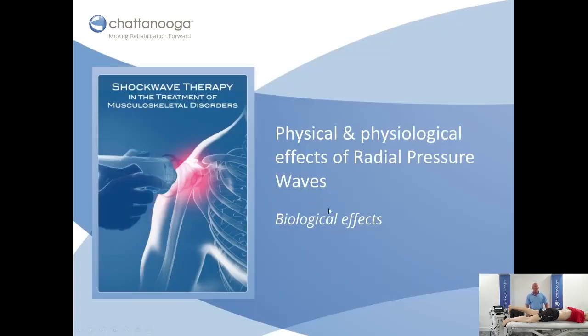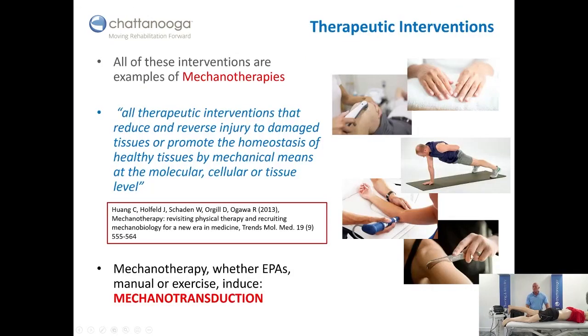Now I want to talk about the biological effects of this energy going into our patients. A lot of therapists are using manual techniques, exercise prescription, as well as electrophysical agents such as radial pressure wave or shock wave. These are all considered mechanotherapies.